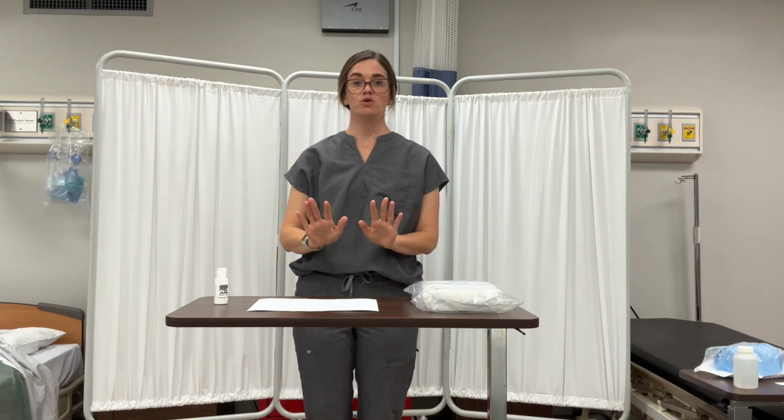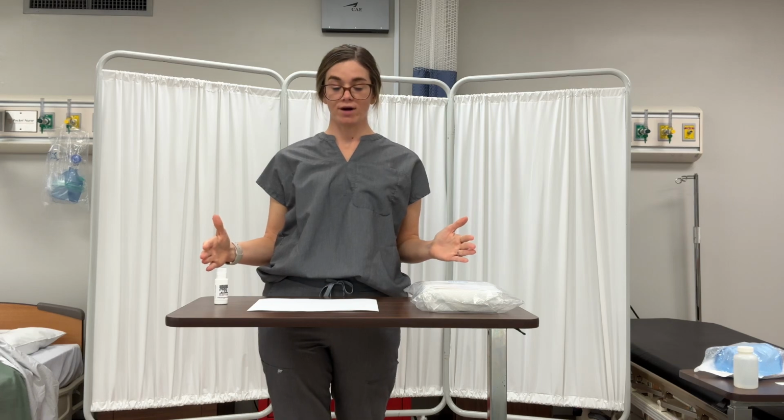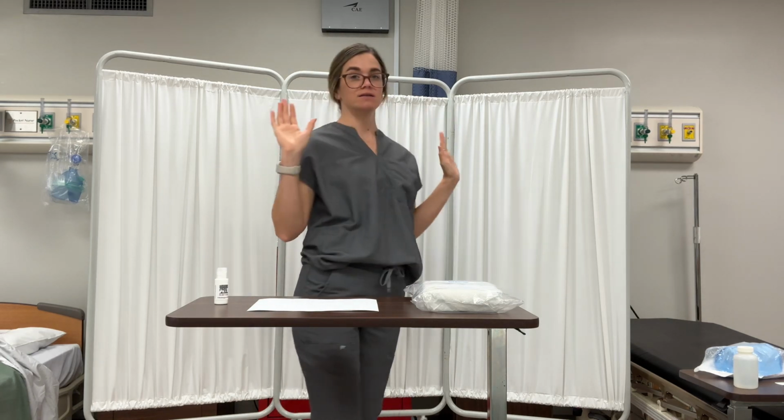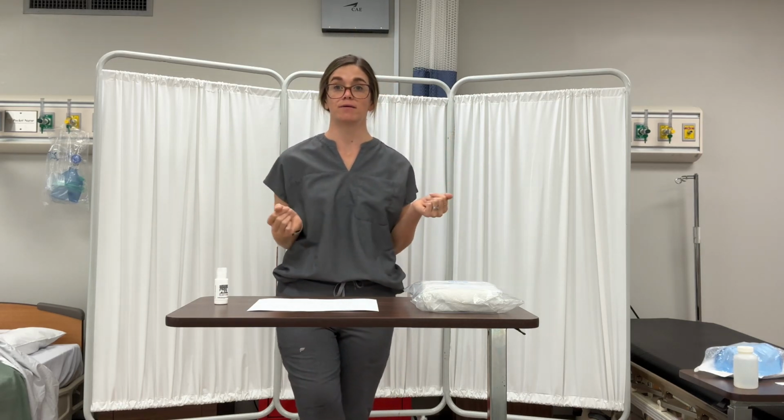If you have your sterile field open right here, you never want to turn your back like this. If you turn your back, it is considered contaminated because you can't see what happened. A sterile object or field becomes contaminated by prolonged exposure to air. Stay organized and complete any procedures as soon as possible.